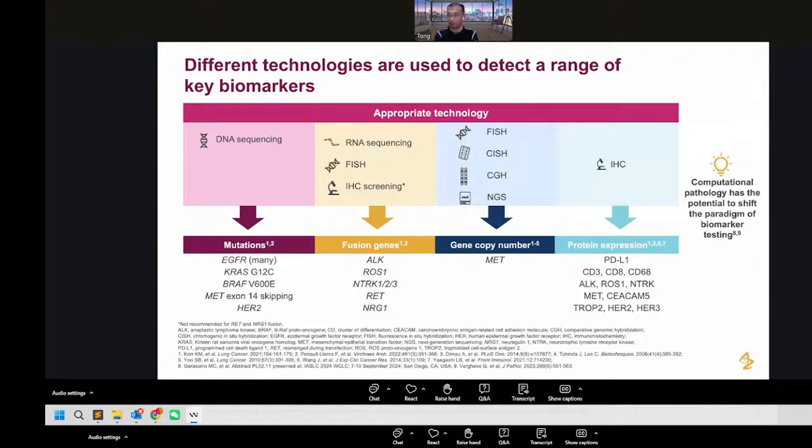So it's 50% positivity or 25% positivity. That's kind of a thing we do. We get the number, the positivity of the different protein expression biomarkers. But one of the big challenges, which we often hear some people saying, is that this is not accurate and this is so subjective, and how can we make this more objective?